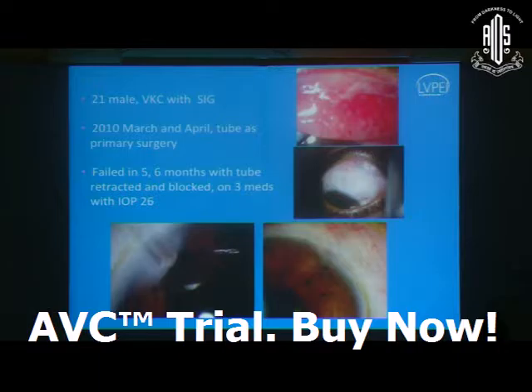Sometimes, especially if you're doing it inferiorly, we may tend to get confused, and when you're trying to cut the tube, the bevel can be down. So once you trim the tube as per your adequate length, now you are in a fix because you have to waste the implant, or you can make it shorter, and it becomes too short.